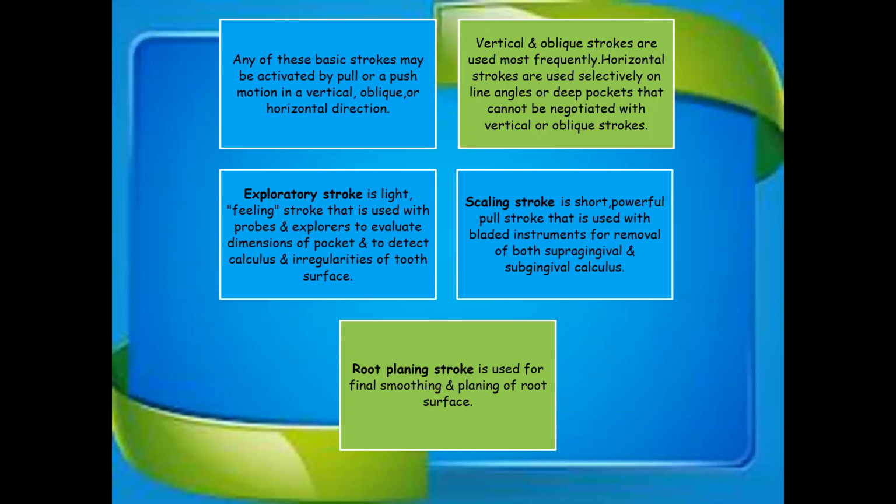So what is an exploratory stroke? It is a very light feeling stroke that is used with a probe and explorer to evaluate the dimension of the pocket and to detect calculus and irregularities on the tooth surfaces. Whenever you are doing scaling or root planing, with the help of the tip of the explorer, using tactile sensation, you can always explore the area to see if there is any residual calculus left.